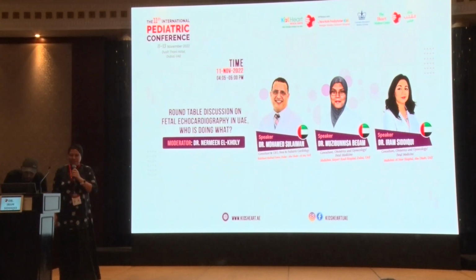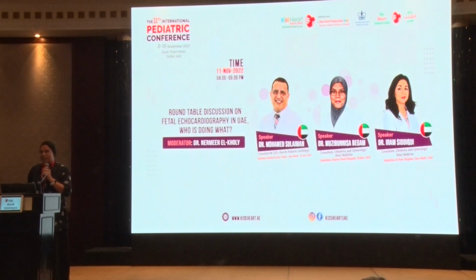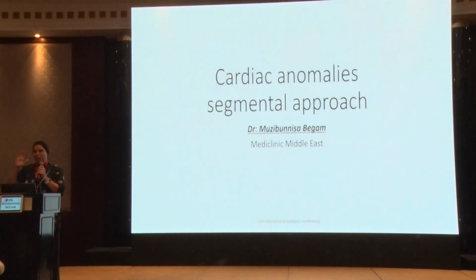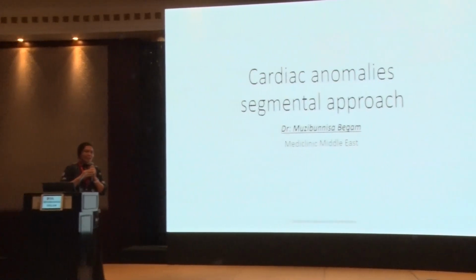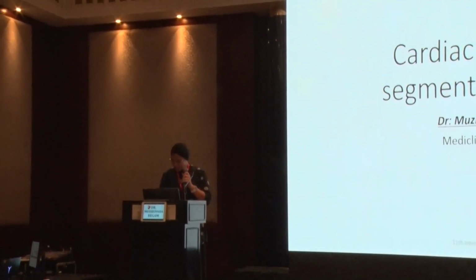Good afternoon, everybody. We had a whole day of nice lectures taking us through different planes, anomalies. We will do a little bit of teamwork in reaching the diagnosis on 2 patients using a segmental sequential approach.